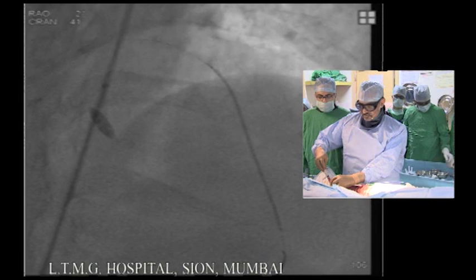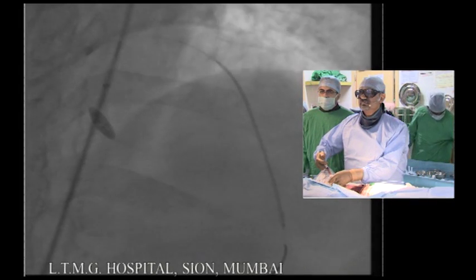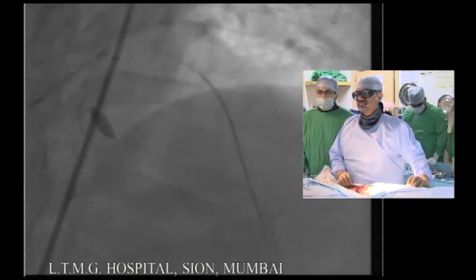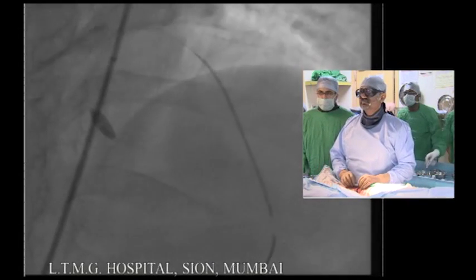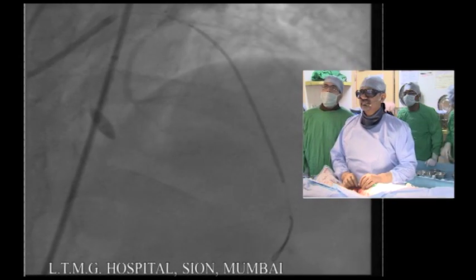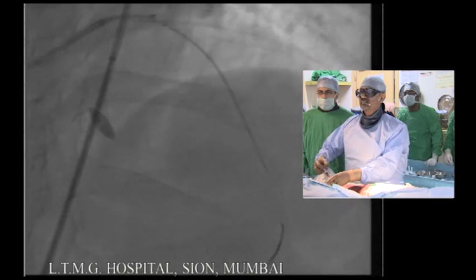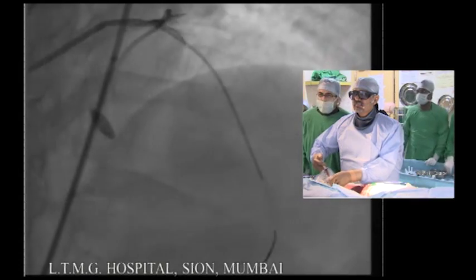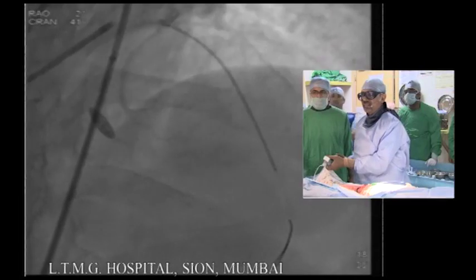I think the stent could be a little bit shorter in this case. Not quite distal part, and without any measurement before, it can make another dissection. So we are just going up.